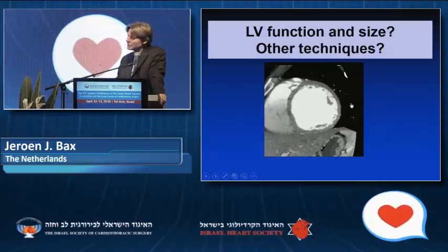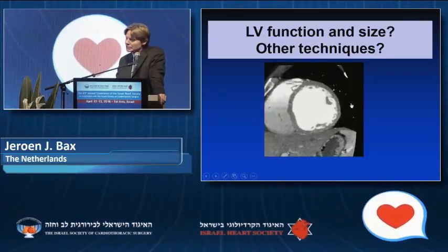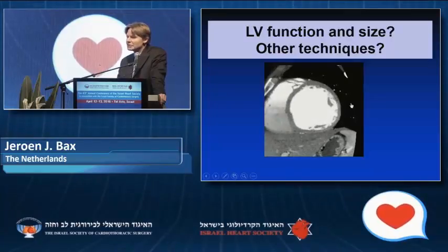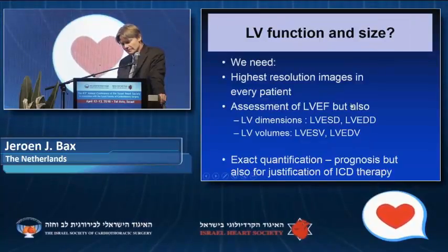This comes from the CT scan, and this is LV function in a severe heart failure patient. But at the moment, as it is now, this comes with significant radiation. That brings it up to about 10 millisievert and plus. So I think this is at this moment not something that you routinely do in the patients.